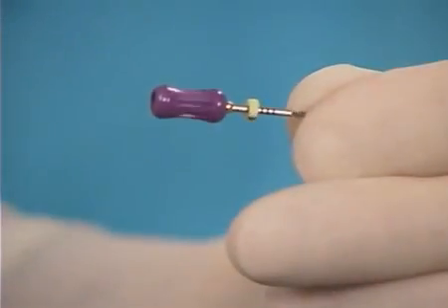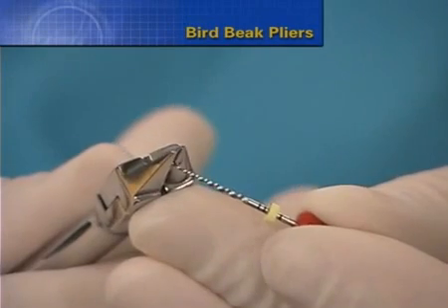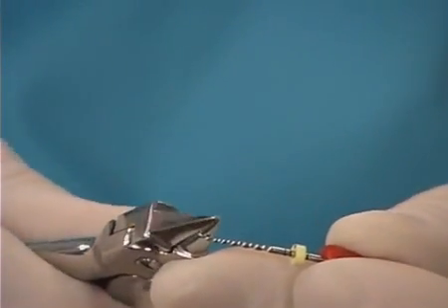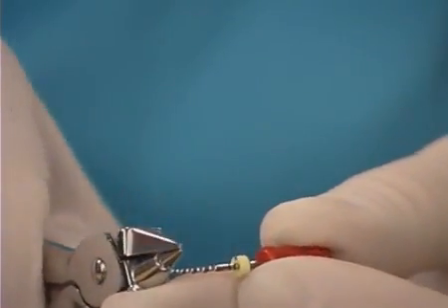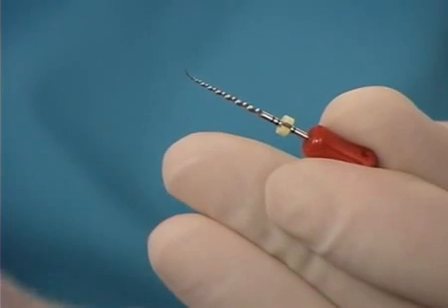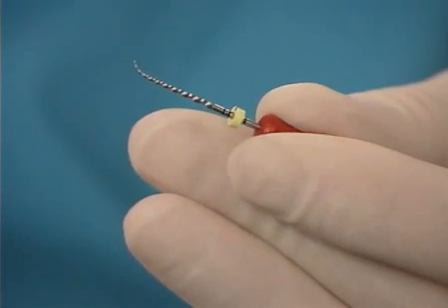NiTi files may be pre-curved utilizing the bird beak pliers. The working end of the file is securely grasped between the jaws of the pliers, and the handle is pulled through a radius of between 180 and 270 degrees. Because NiTi files have shape memory, efforts to bend these instruments must be exaggerated so that when the instrument is released from the plier, it will have the desired curvature in its apical extent.